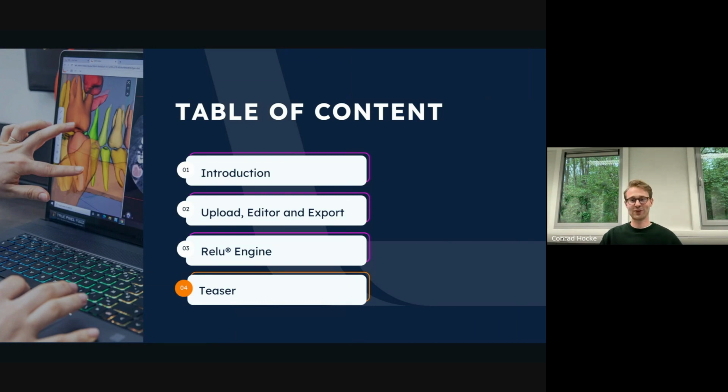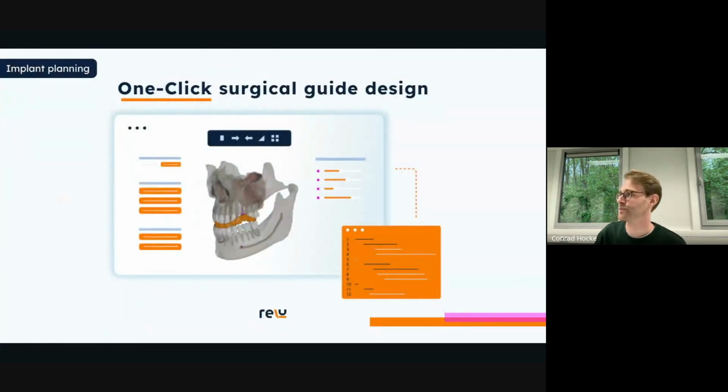All right, now to the little teaser. This is actually one of the products that gets me really excited to be working at Relu, because I think this can have a very positive impact for a lot of people. As of now, only 1 in 1,000 lost teeth gets replaced with an implant. Why is that? The main factor is cost, and another big contributing factor is that a lot of dentists hardly ever place implants, as they're not very confident in their placement, which is honestly a shame.